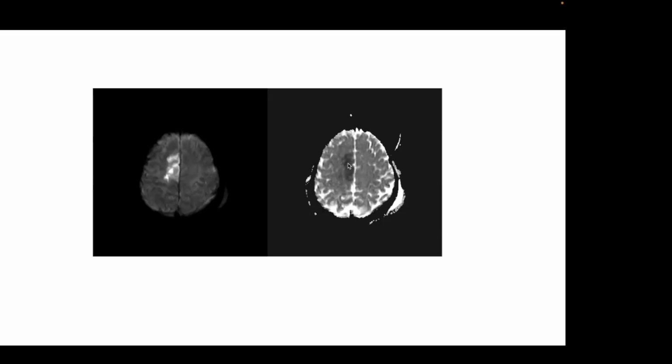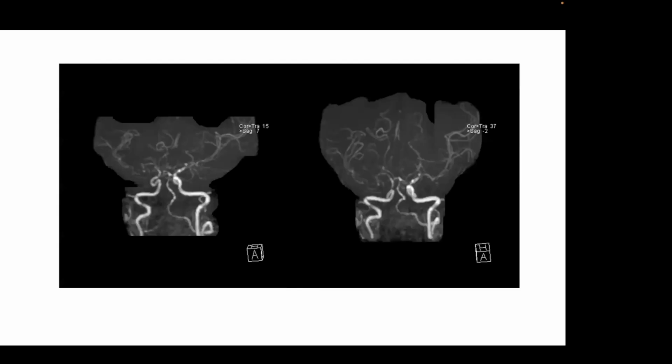This complex of symptoms, this clumsiness, is a little unusual. Sometimes you'll see these supplementary motor infarcts in your practice, and oftentimes the patients will recover from those infarcts. But what we know is that the involvement is not just here. We know that there's some abnormality of the whole hemisphere on this side. If we go to the imaging, you'll notice there's diffuse disease. Neither side looks normal.